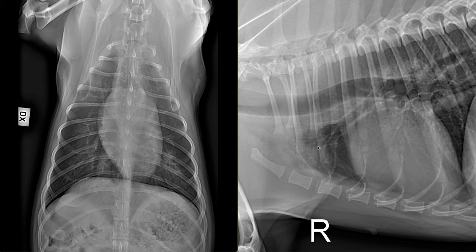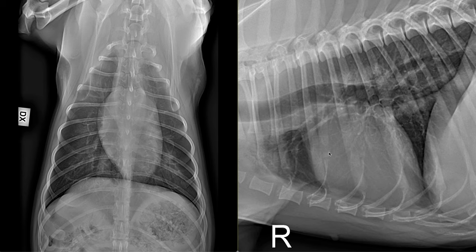So soft tissue opacity with air through the airways. And we have lobar margination, or distinction, of the cranial lobar margin by changes within the pulmonary parenchyma of the left caudal lung lobe. The silhouette of the heart, the great vessel, the pleural space, the diaphragm, and the thoracic margins are all within normal limits. The skeletal structures are also within normal limits.